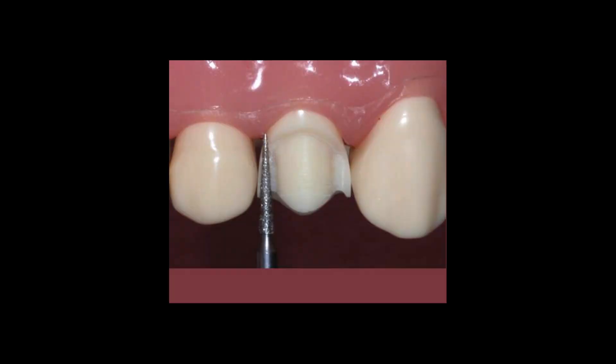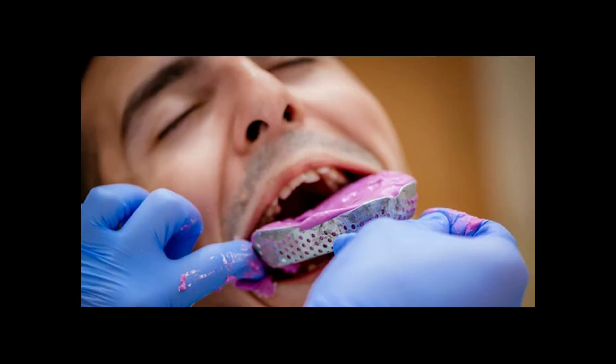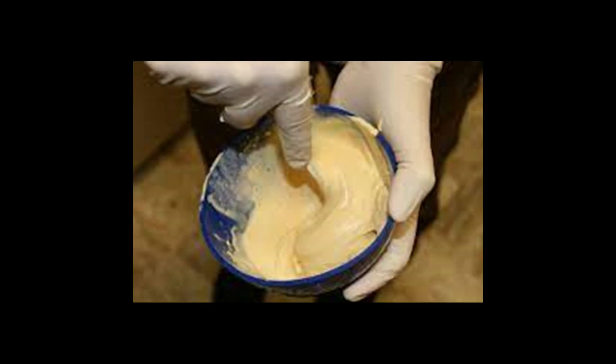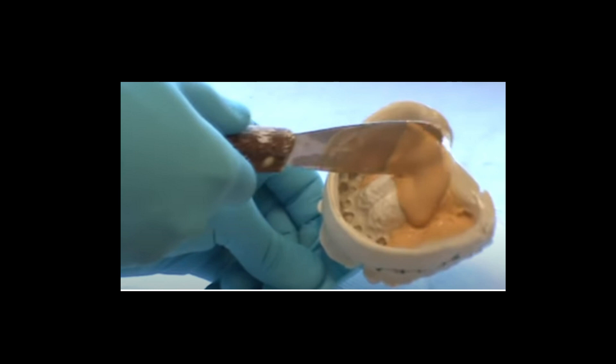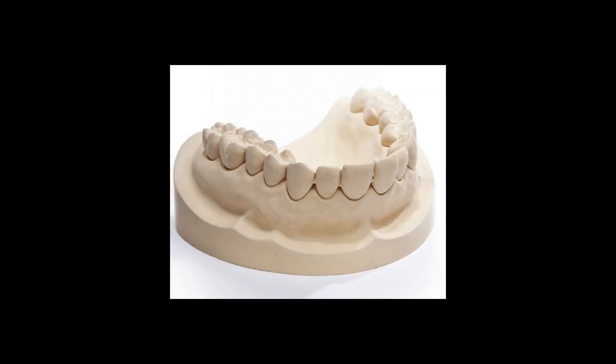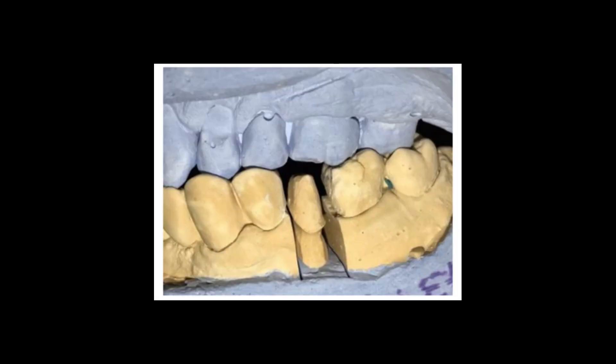The first step is to prepare the tooth. This means that we have to use a burr and reduce the tooth so that the crown can fit perfectly. Then we take an impression of this, and the impression will look something like this. We pour the impression to get a model. Once it sets, it will look something like this that you can see here — the prepared tooth's model.